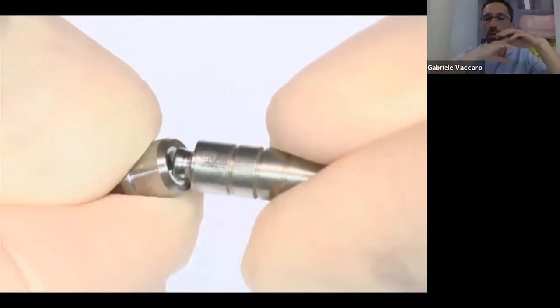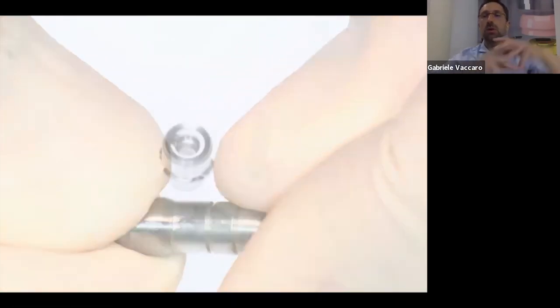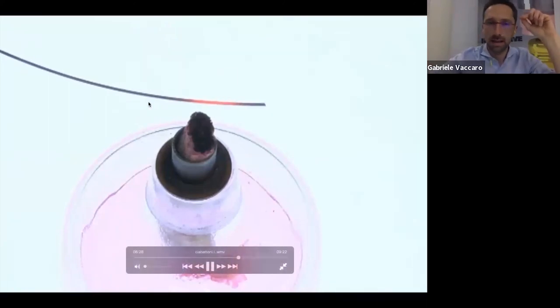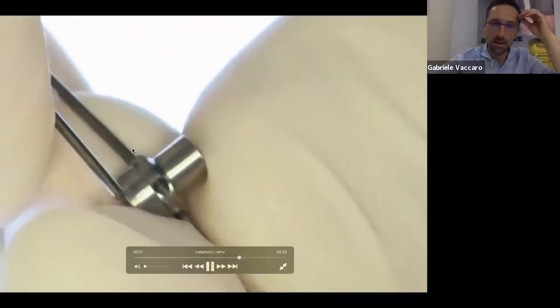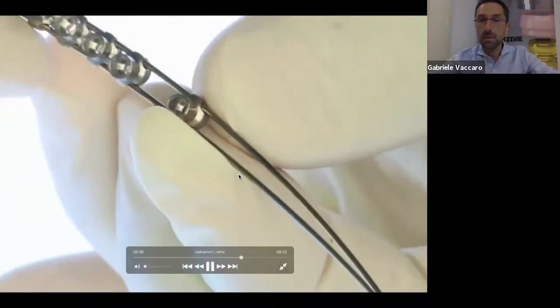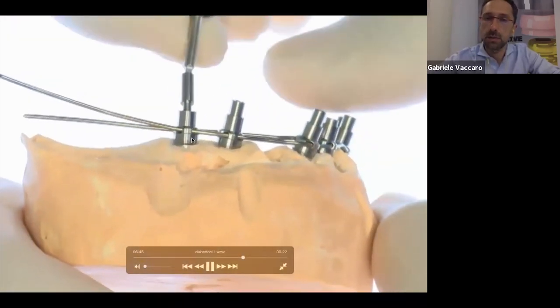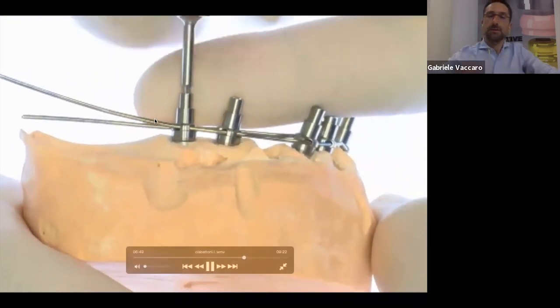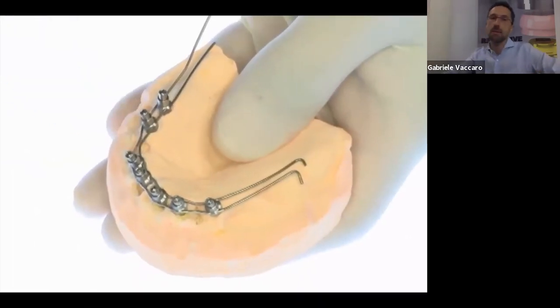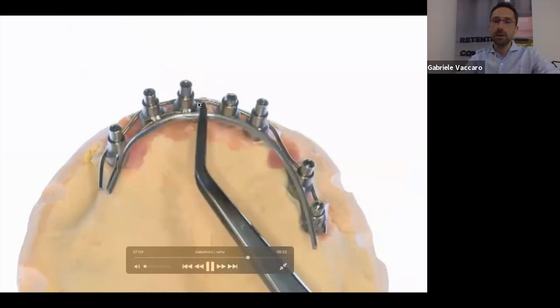A metal wire, a titanium wire. You need a titanium wire, it's in the catalog, because you need a wire that doesn't have any elastic memory. So this was an iron made, a steel in the beginning. I used this steel wire, but this doesn't count. If you use the titanium wire that you have in the catalog, you don't have this problem that I had in the beginning. So once everything is put inside, like a necklace, exactly, everything is kept together by the wire, titanium wire, that is pliable without any elastic memory. You ply them, and then you fill everything up with resin.